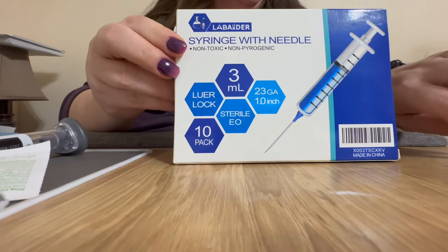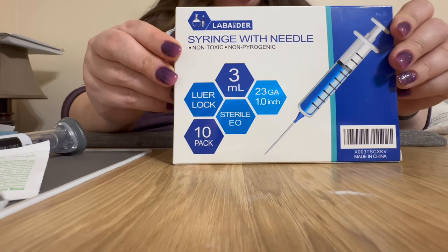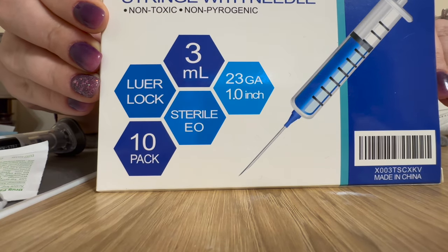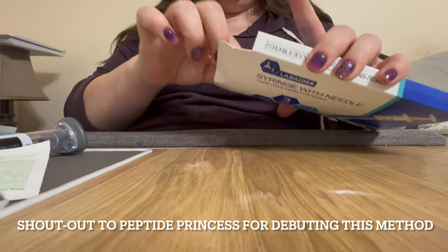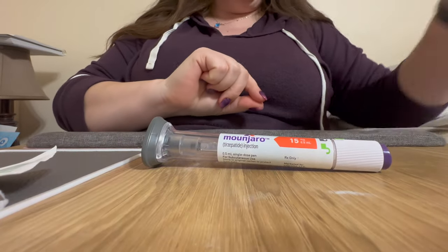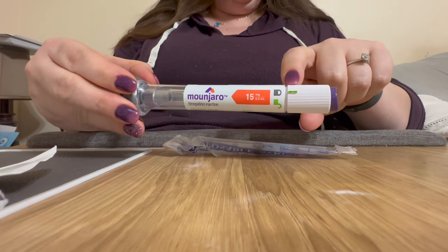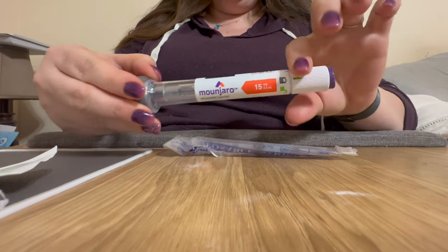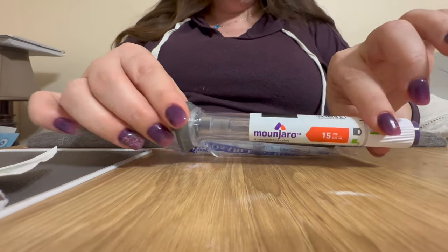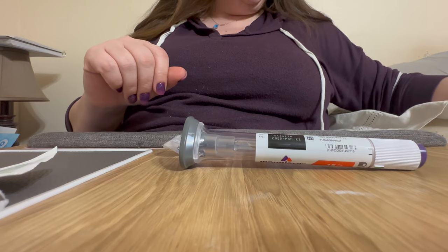The first thing I use — I know there's a lot of information out there about how to take the Mounjaro pen apart manually, but I don't want to do that. I use a slightly larger needle to nest over the top of the small Mounjaro needle to draw out the medication. That way you never have to unlock the pen, you never have to push the button, you don't have to take the pen apart, so there's zero risk that you're going to waste your medication with a misfire.